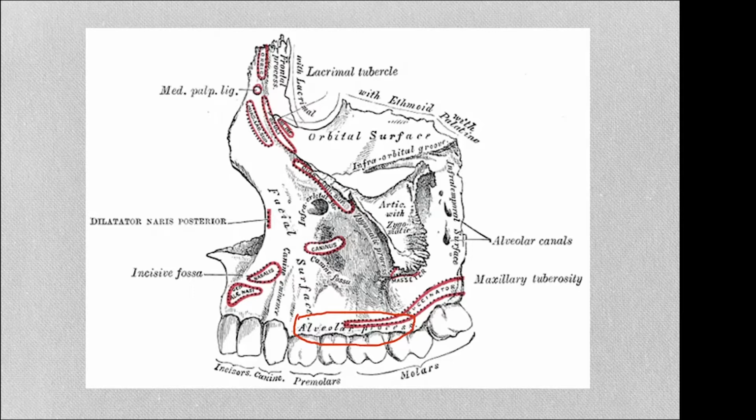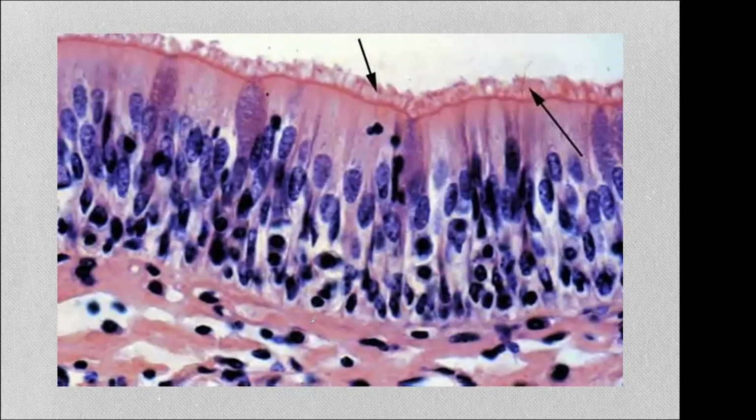Now, when the sinus is pneumatized or hyperpneumatized, it will occupy that bony space. And all of a sudden, instead of having room for implants to be placed unhindered with plentiful bone all around them and good circulation, now you have the space or the void of the maxillary sinus, an air cavity. Now, the talk obviously is about managing that and pushing it out of the way. What do we push out of the way? What is the it that we push out of the way? It is the maxillary sinus mucosa.